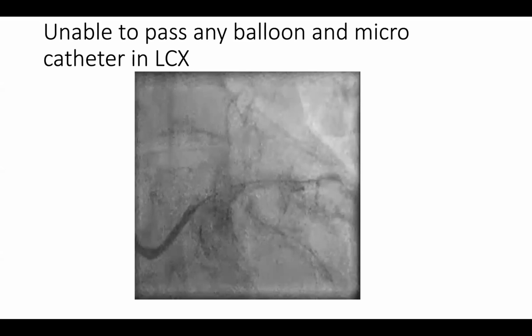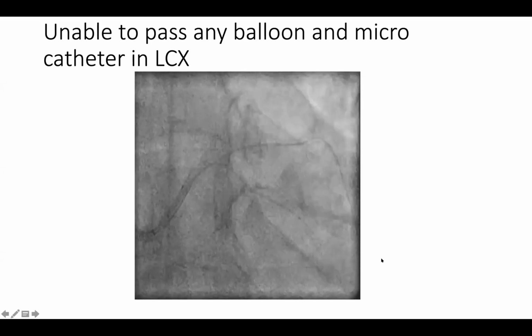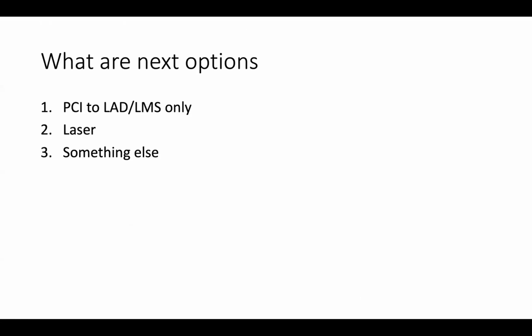Okay, what did you get for the poll results out of interest? Yeah, I think 40% said, let me bring it up again, sorry, one second. There we go. This is what people said. Can you see it? Yes. So not many answered, but of the ones who did, 40-40, laser and something else. I wonder what that something else is. I mean, I guess laser is only helpful if you have it available in your cath lab. There are many cath labs, unfortunately, which don't have laser.